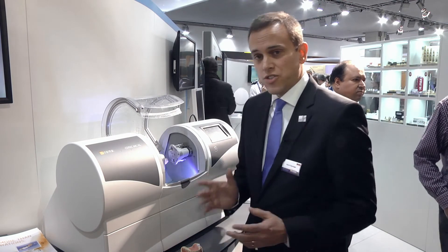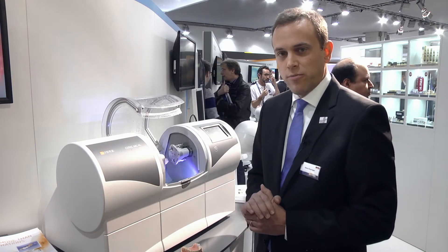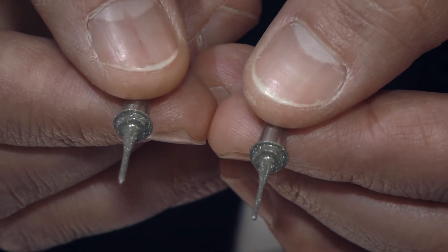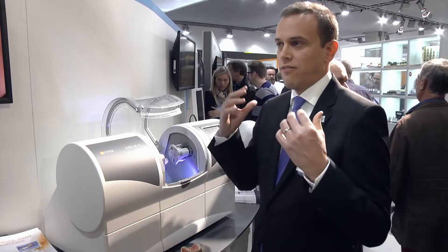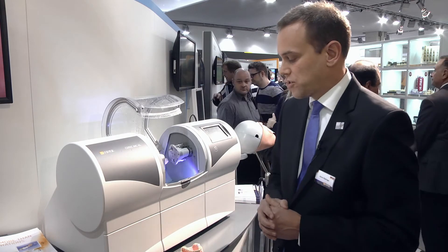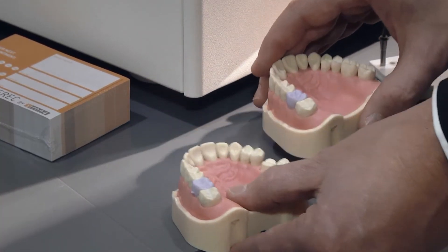Both of the burrs also have a finer diamond grain structure. And so the final contours have a smoother appearance than with a normal grinding process.